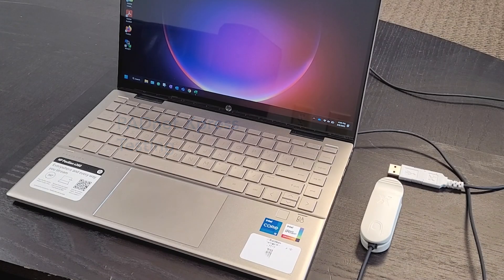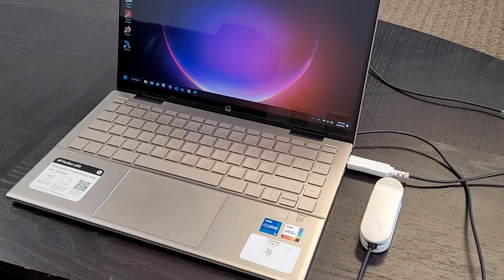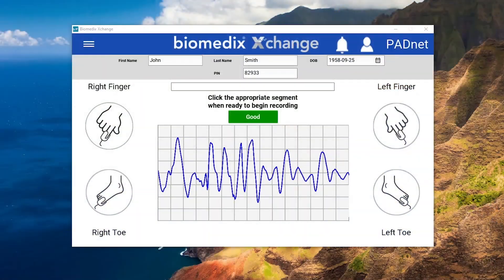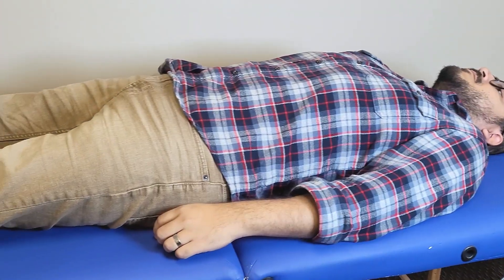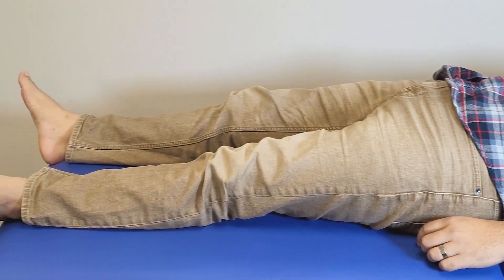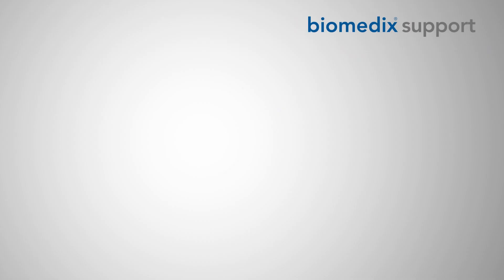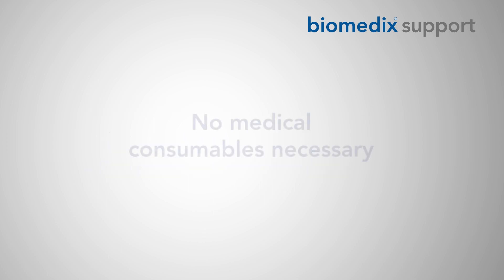To prepare for testing, plug the sensor into your testing device and open the Exchange application. Look for a blue tracing traveling across the screen to confirm proper connection. Have your patient rest for a few minutes lying in a supine or sitting position, and remove their shoes and socks for testing. Note that the device is capable of testing with cold toes and filtering out ambient light, so no medical consumables or extra preparation are necessary.